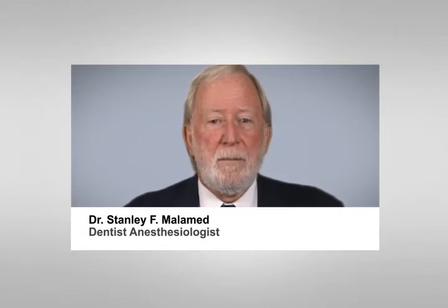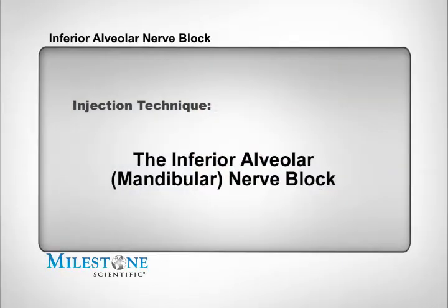The STA system allows you to use the birotational insertion technique to prevent needle deflection, minimizing missed blocks, making your blocks more accurate and providing a shorter onset of anesthesia. Additionally, the STA is the only injection system available that allows one to employ a unique multi-cartridge injection. Let's discuss how to begin. Injection technique: the inferior alveolar mandibular nerve block.